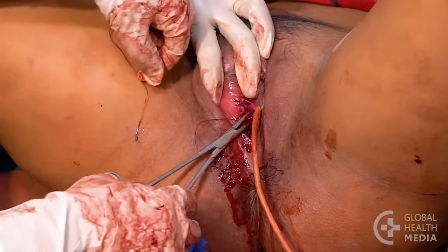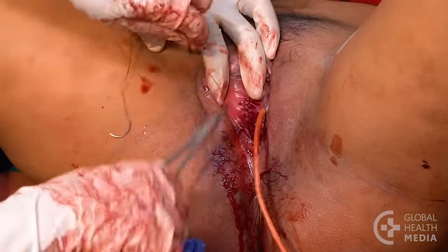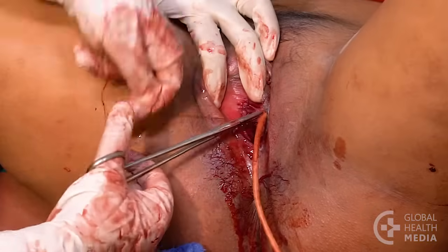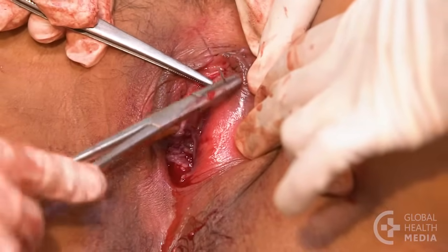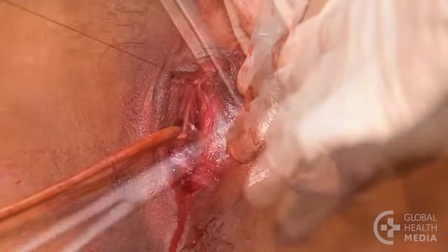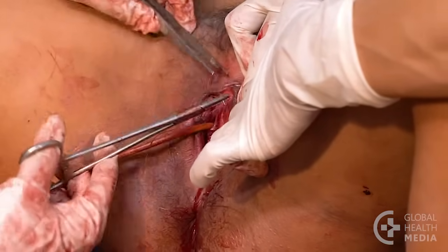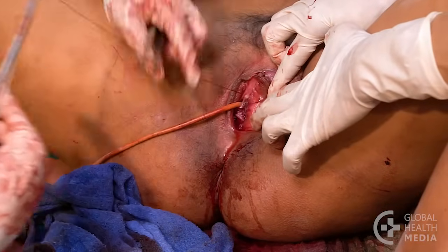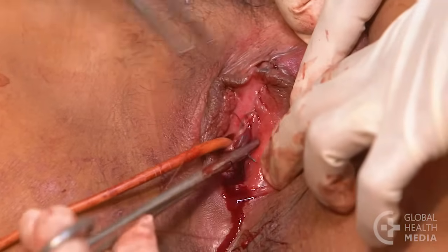Place a knot at the end. Now after placing an anchor stitch, suture the other side. Again, use shallow stitches. The sutures placed so close to the urethra emphasize the need for the catheter.